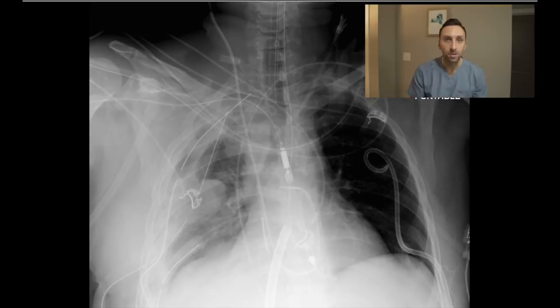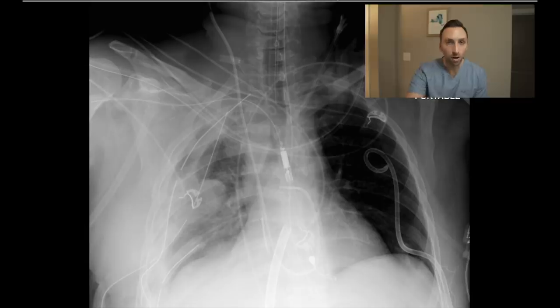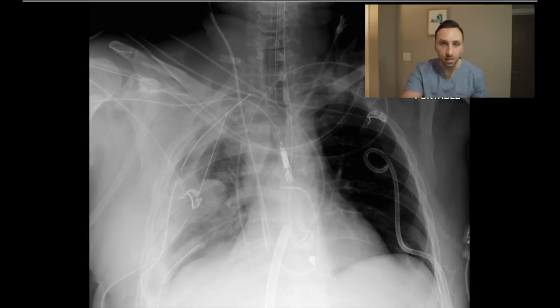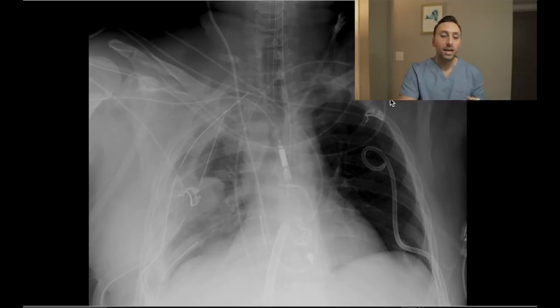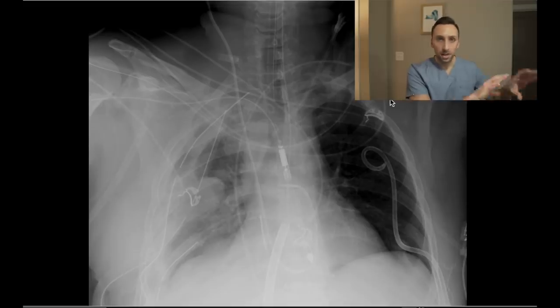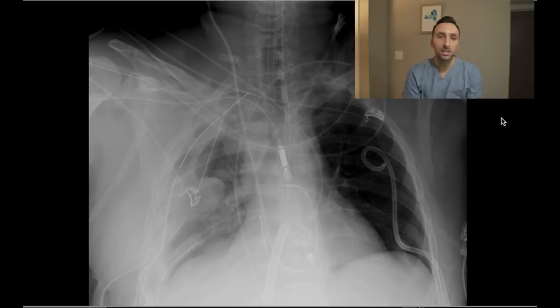Most of your patients are going to look like this when they are imaged in a hospital setting, especially if you have an ICU — we get a ton of x-rays like this per day and they can be very complicated and daunting to a beginner. However, search pattern is key. If you don't have a search pattern, you can go watch my previous video — I'll put a link up here — and then come back to this one. My search pattern is a little different when I read ICU or portable radiographs than when I do a normal outpatient x-ray. The very first thing I do is look at the lines and tubes.